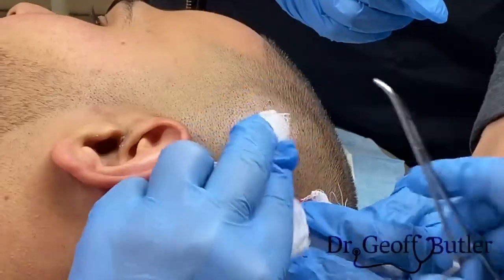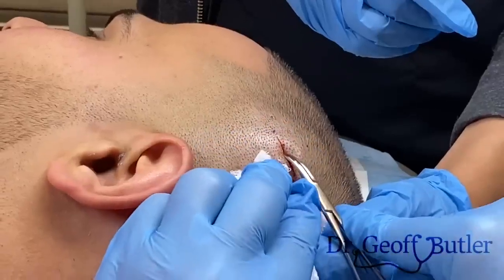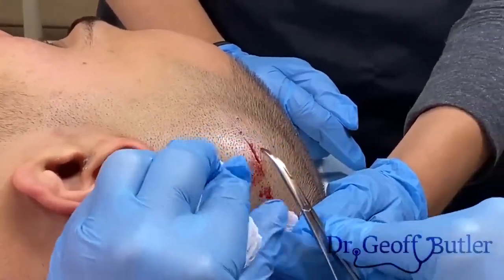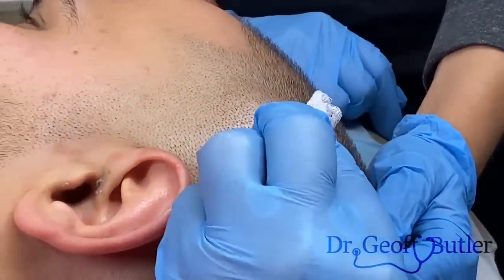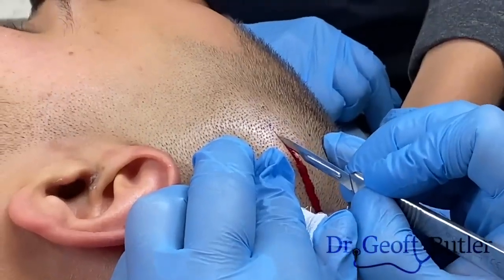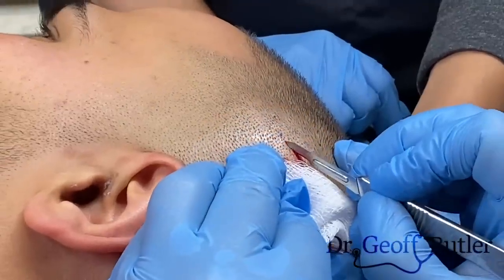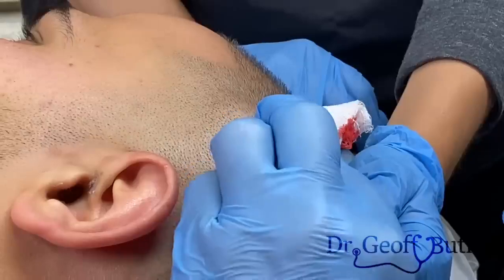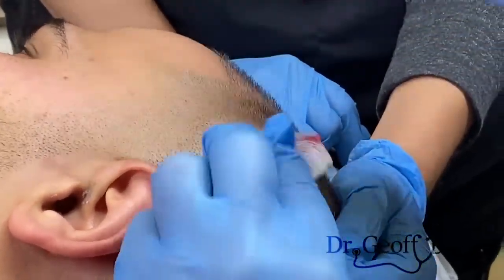Like most surgical procedures that we do, but especially scalp ones, it's all about finding the right plane. So making sure this starts, as soon as we get below the dermis and it starts to open up, then we'll know that we can dissect this down more. And again, like any other spot, bleeding planes are critical. The scalp has a big blood supply, so we want to make sure we're not putting him in a position where, once we start, it bleeds down either into his face or onto his chest. Seems like a minor issue, but you want to consider it so that you have good procedural flow and you don't panic when all of a sudden something is extending into a spot we don't want it to be.